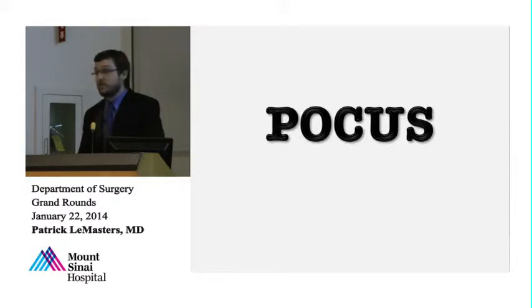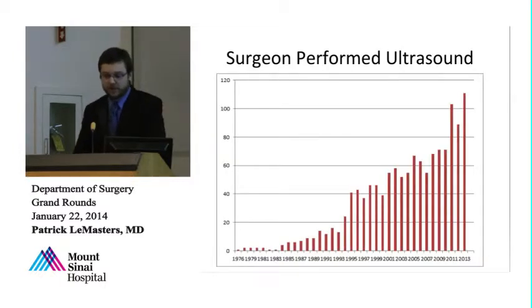The point-of-care ultrasound is focused ultrasonography performed by the surgeon at bedside, and it helps you decide what you're going to do with your patient. So just looking at the literature, if you do a literature search on surgeon-performed ultrasound, you can see that there's a stark increase from the 1990s to the present day, with increasing data showing the validity of these studies done by the surgeon.